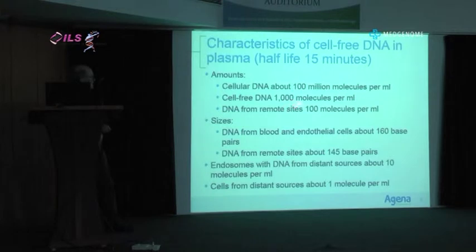Okay? So if we have a tumor which is 10% EGFR mutant, and we look for that allele in plasma, it's going to be 1/10 of 10% or 1%. Okay? So the methods that Darryl has showed you up till now with about a 5% sensitivity limit simply can't be used in plasma. They might work for some patients, but they won't work for all patients.